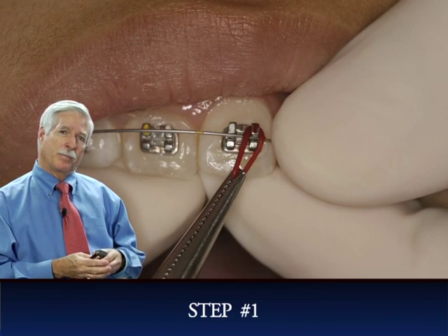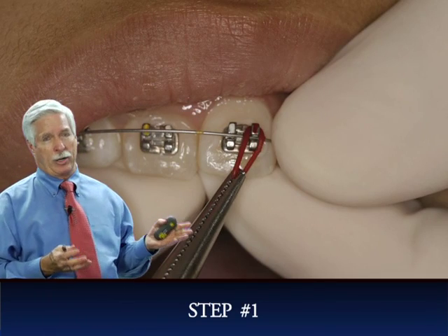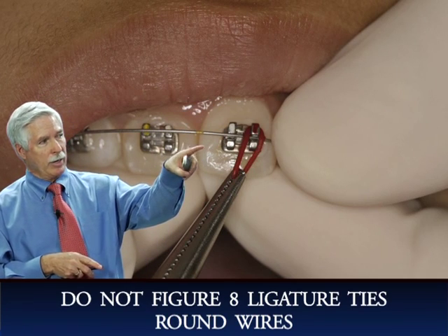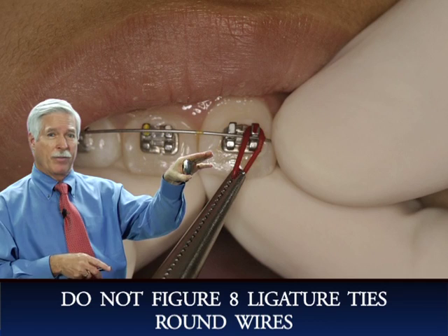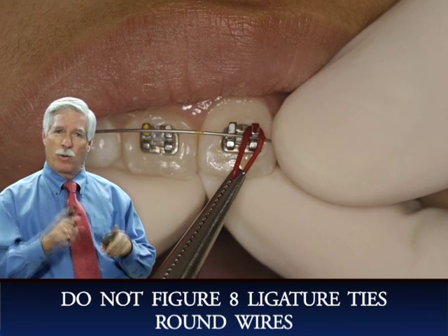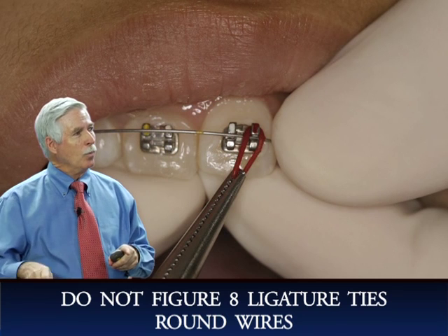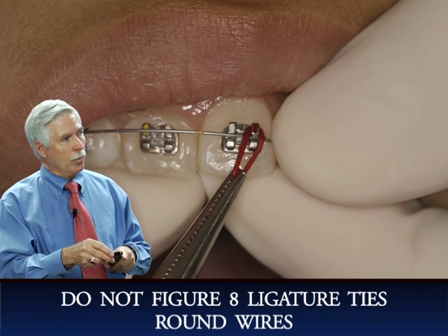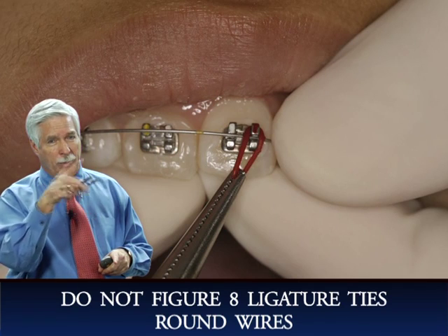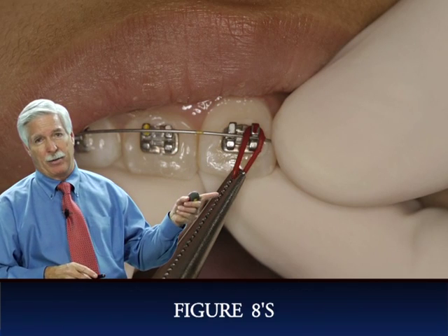Now, actually for the round wires, I'm not figure eighting. This photo is a little older, and we were figure eighting all our cases in the beginning. But now we're just putting that Sani tie or donut around all 4 wings of the bracket. Here we're doing a figure 8.